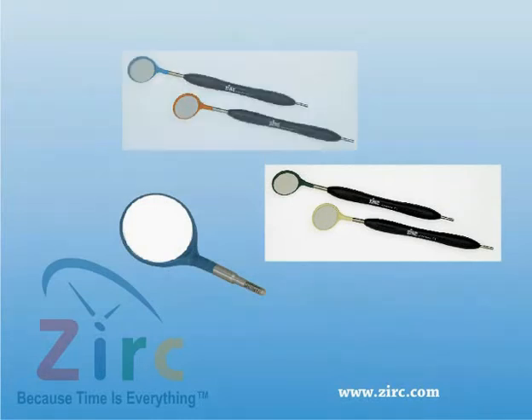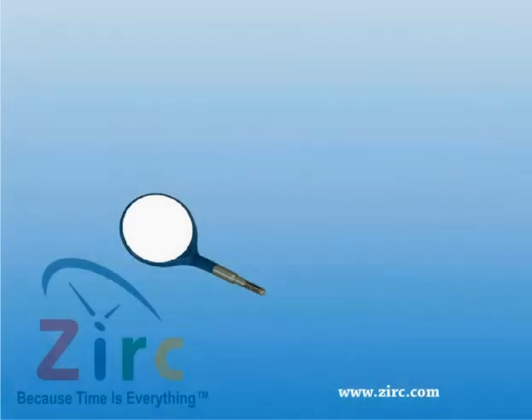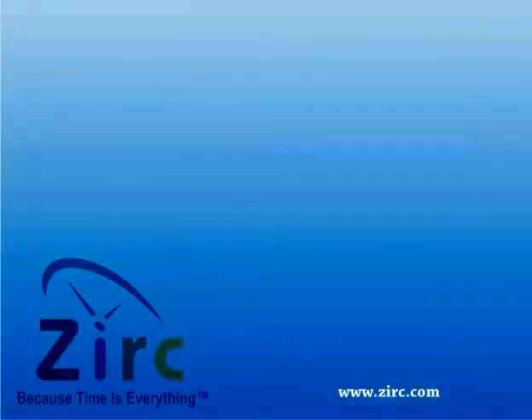Another feature of the Crystal HD mirror is that it contains Microband, an antimicrobial additive that is built into the product. This helps in preventing disease-causing bacteria and microorganisms that may grow.